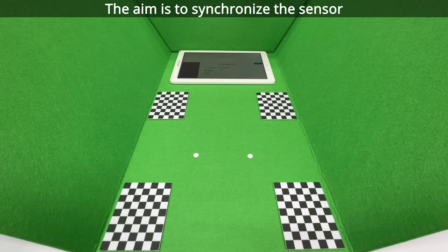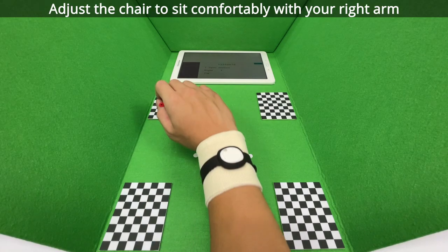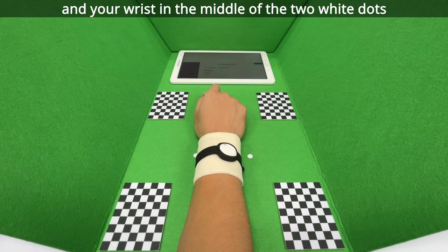The aim is to synchronize the sensor on your wrist with the video recording. Adjust the chair to sit comfortably with your right arm resting on the bottom of the box along the center line and your wrist in the middle of the two white dots.